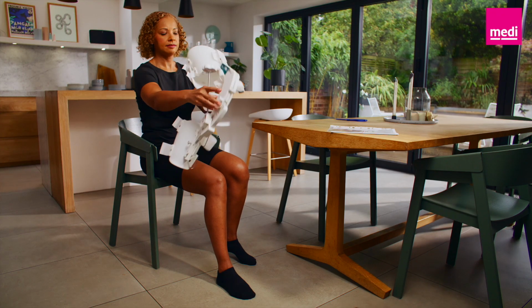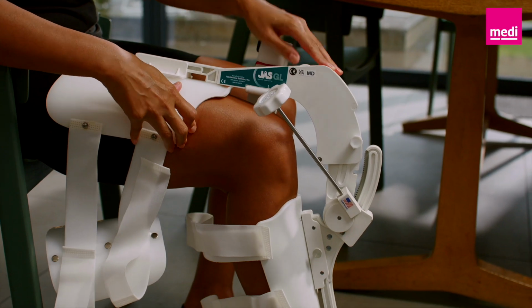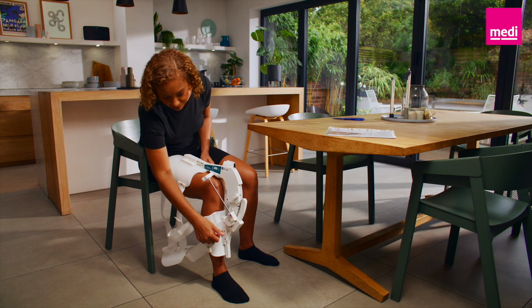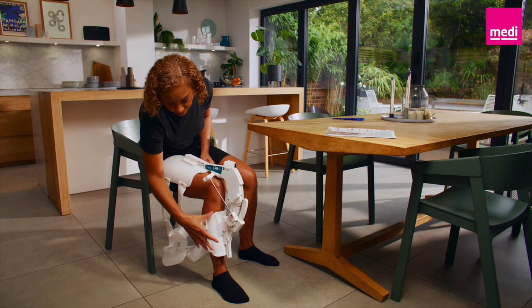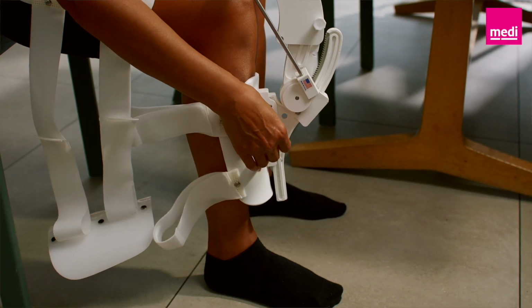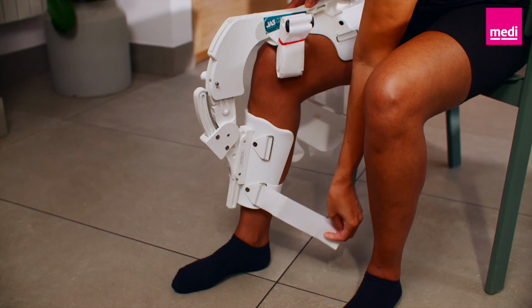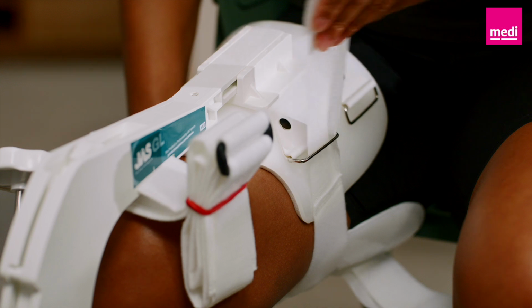To fit the brace, first loosen all straps, then place it over your leg and ensure the device label arrow points down over the top of your knee. Adjust the shin cuff so it's centered on your lower leg. You can do this by loosening the gray turning dial to move the cuff up or down, then tighten to secure its position. Fasten the shin and thigh straps through the D-rings and secure for a comfortable, snug fit.